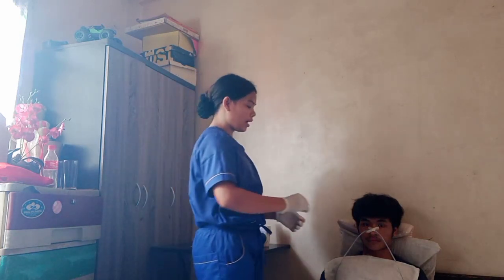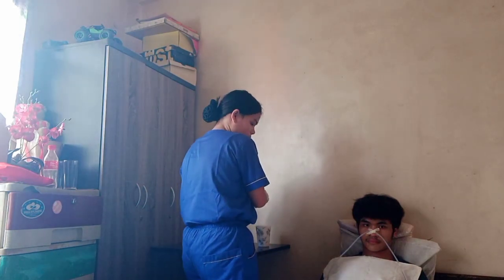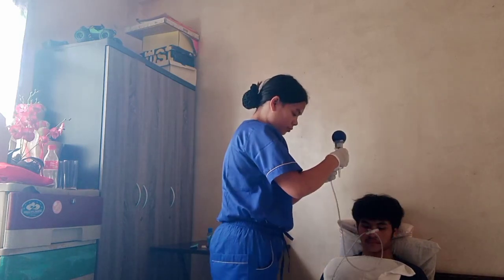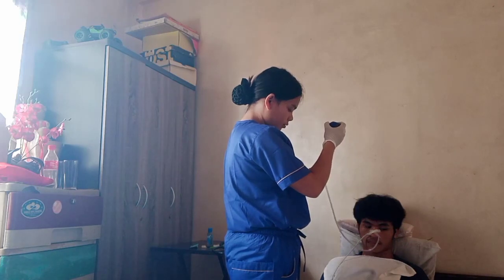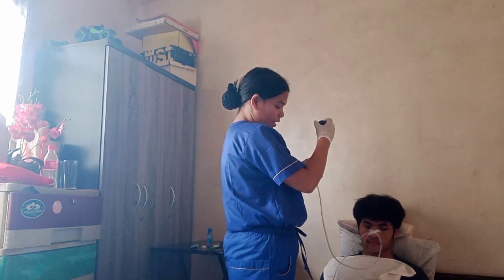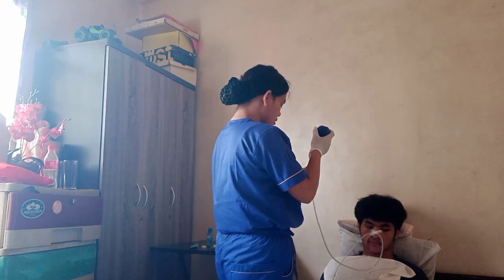Then, after that, we will now proceed to the NGT removal. So, place a towel across the client's chest to protect from secretions. Then, flush the tube with 5 to 10 ml of NS.